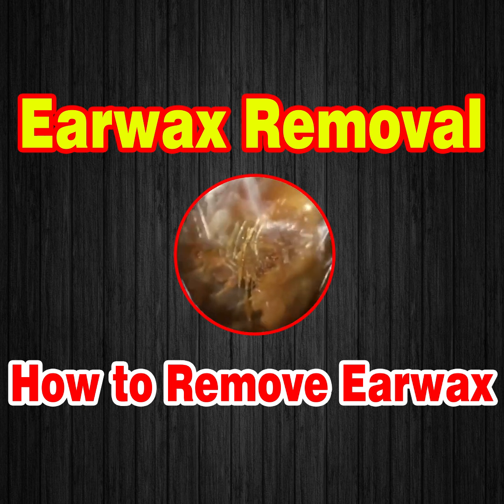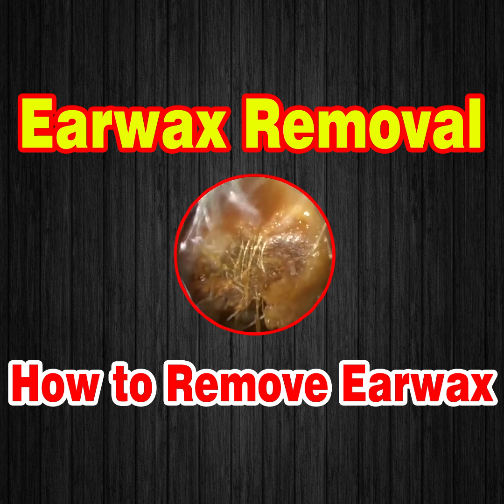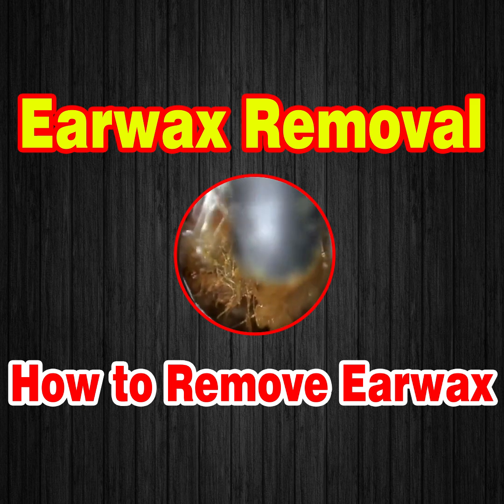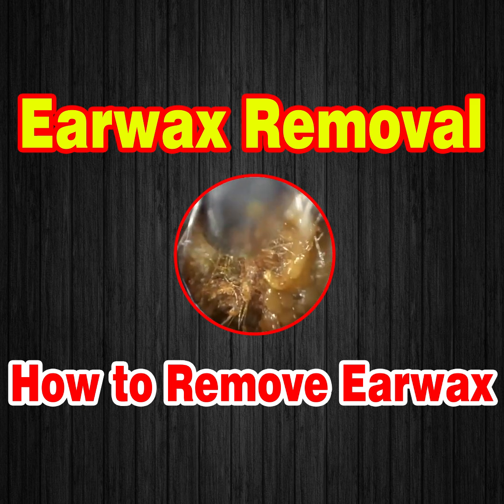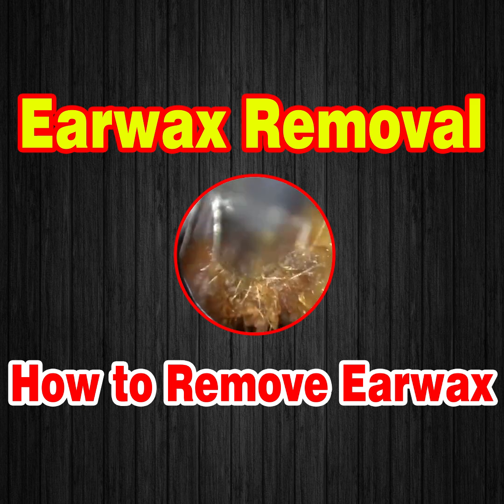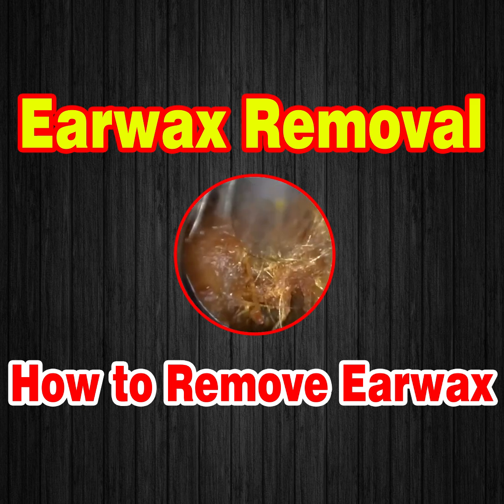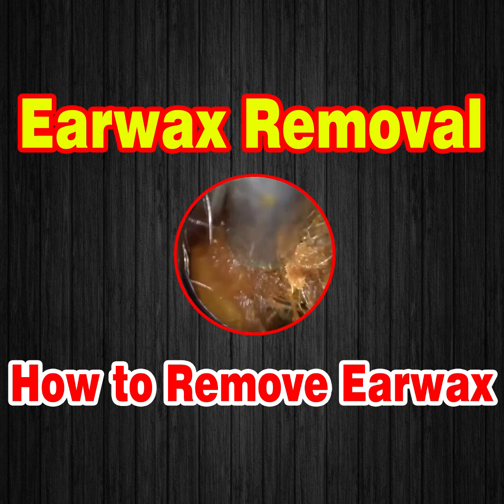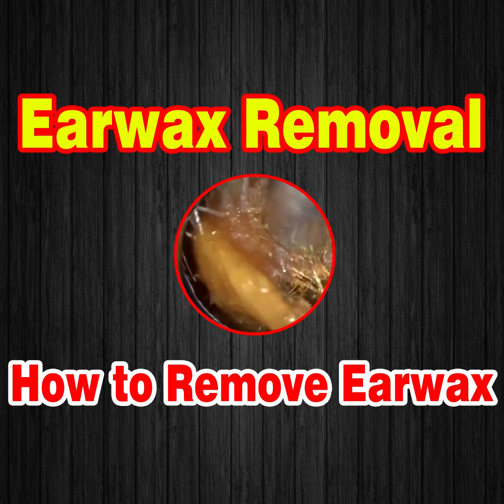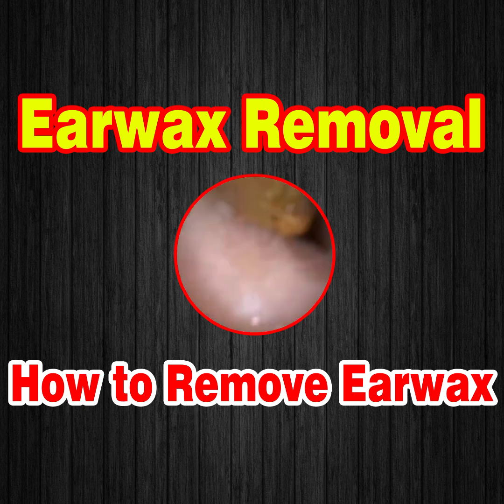So most people in the UK still don't use an endoscope, and that's for many different reasons, but probably one of the biggest reasons is it is quite a difficult skill to acquire, because unlike with the WAXscope or the microscope and the head loop, there's no speculum involved. You're having to stretch and dilate the ear canal using the side of the endoscope. So there's a lot of bilateral integration. You're using coordination between both hands.